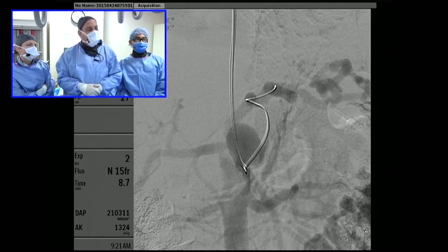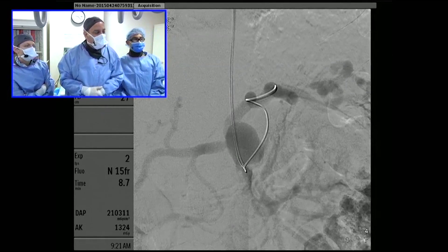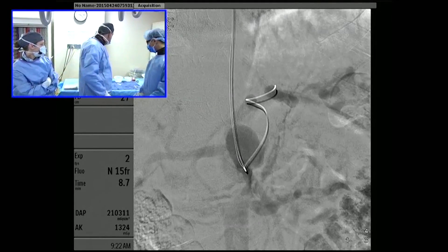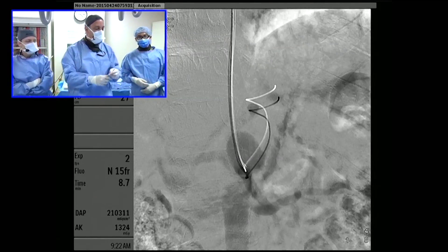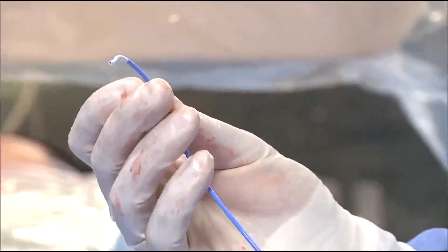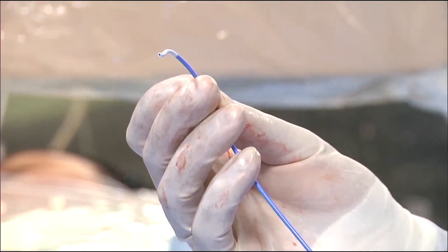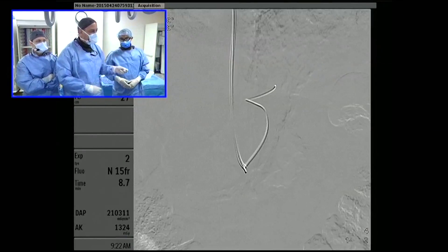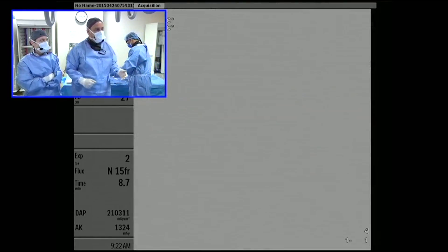Here we were able to exchange out the 5-French diagnostic catheter over a floppy exchange-length wire for a 6-French guiding catheter. This is a JR4 catheter, approximately 110 centimeters in length. This guide system is manufactured by Boston Scientific, who have been tremendous partners with us in developing a whole assortment of radial guide systems to allow us to do these complex cases.